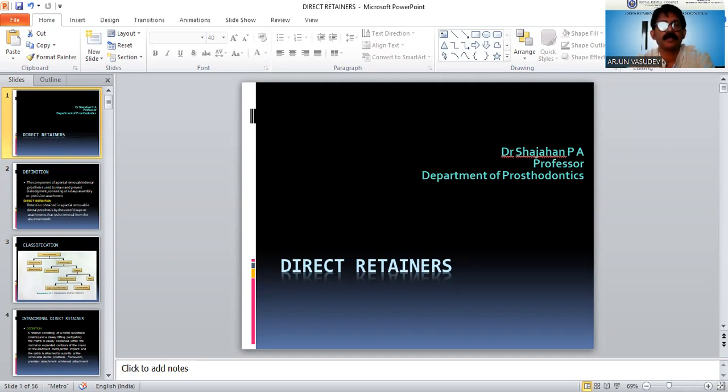Tissue and denture when a removable dental prosthesis is in place, but not under masticating pressure. So when your entire appliance, the entire removable partial denture, is seated inside the mouth, if it is not functioning, the entire clasp assembly, wherever you have provided the clasp assembly, should passively engage. It will activate only in the functional stage. Otherwise, it will cause orthodontic migration of the tooth.